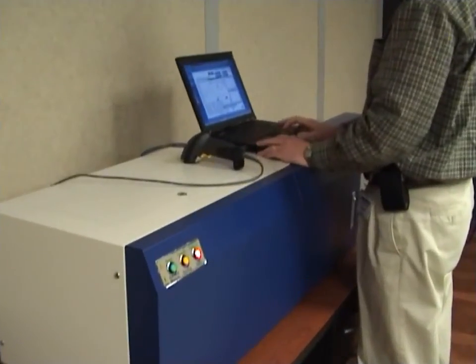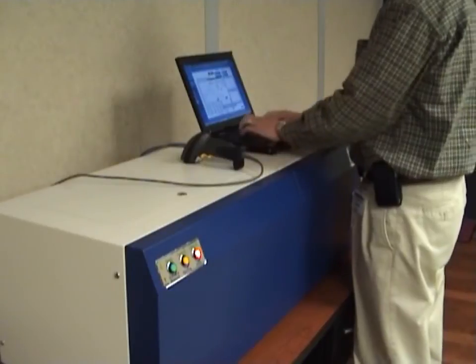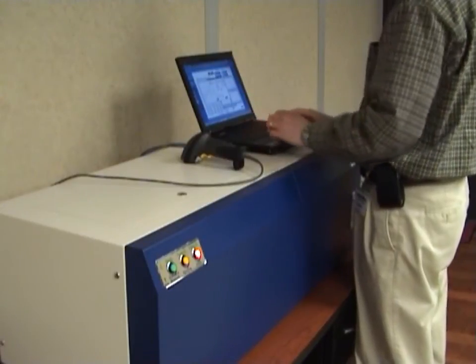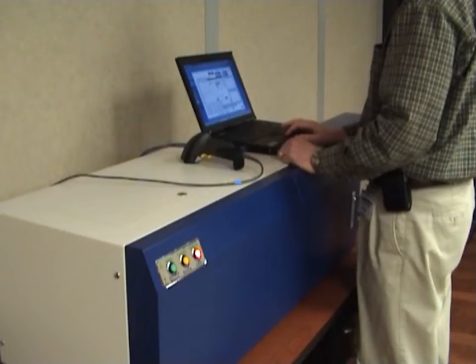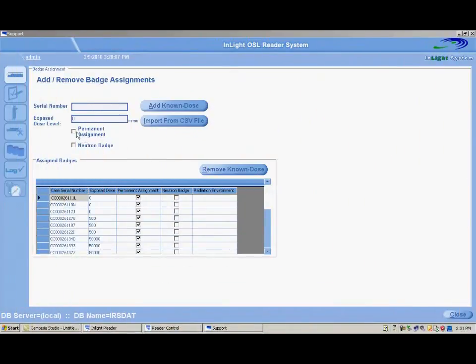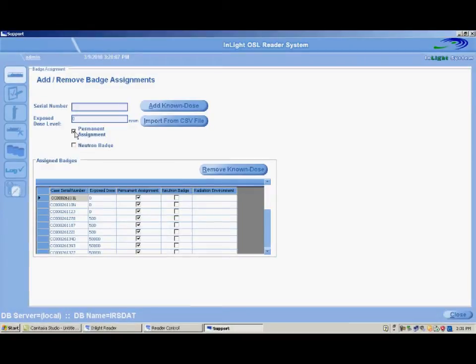Prior to starting a calibration, the calibration dosimeter serial numbers and doses need to be entered into the system. Click the Support button from the menu screen and select Badge Assignment. Select the Permanent Assignment checkbox so that the dosimeters will remain as known dosed badges. If the box is left unchecked, the dosimeters will be removed after they have been read one time.